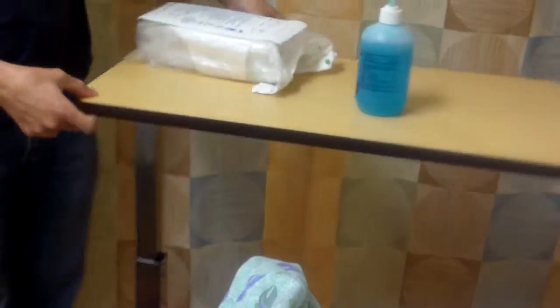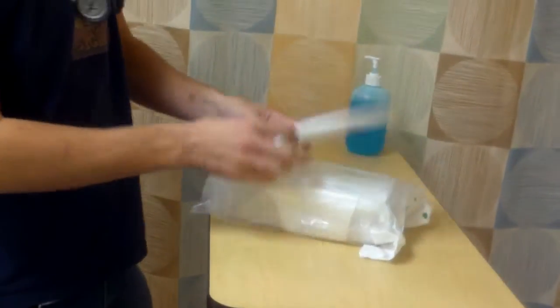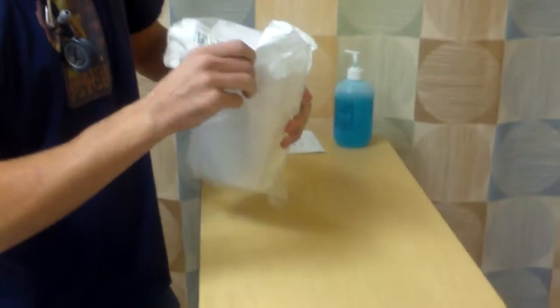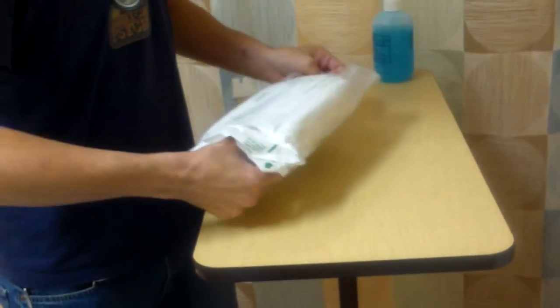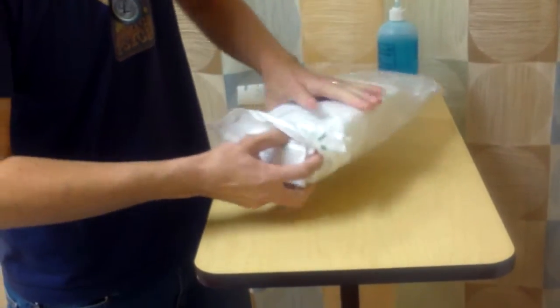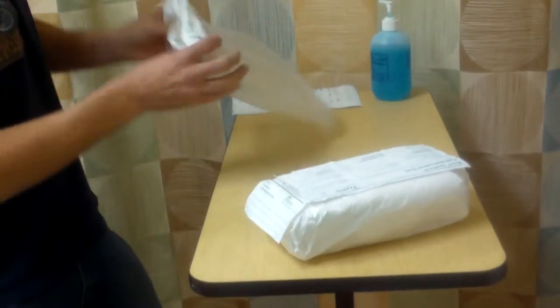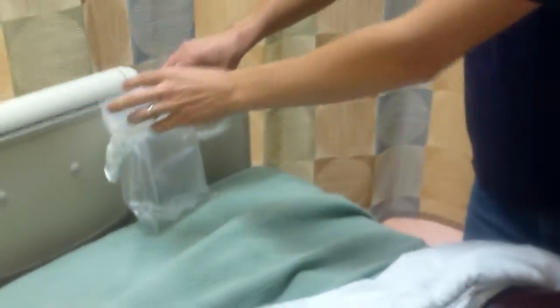More hand hygiene. I'm gonna raise the bed, or my table rather. I like it going this way, to above waist height. So, the kit's intact, it is good. Okay. There you go. This is going to double as my garbage. Okay, put that at the end.